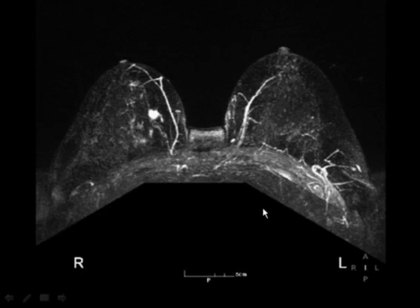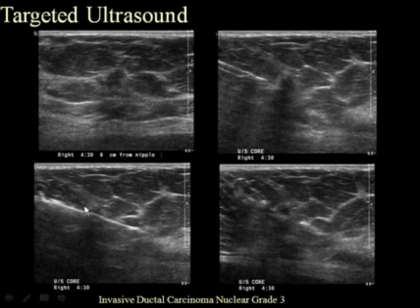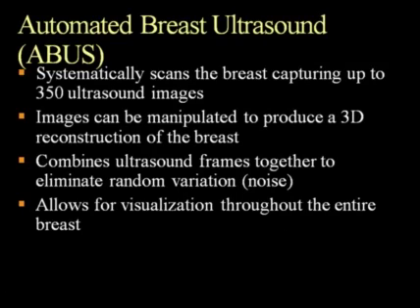The patient was also scheduled for MRI, so she went on after her mammogram to have her MRI, and we see this enhancing mass medially, very suspicious. So now we go ahead and bring the patient and do targeted ultrasound of that inner part of her right breast, and this lesion that's quite subtle, hypoechoic, angular margins, decreased through transmission is here, and this required a biopsy, and you can see our needle biopsy going right through it. This turned out to be invasive ductal carcinoma. So here's our needle up here and going through the lesion. This is a small lesion, so the ultrasound was very helpful as a second look ultrasound after the MRI showed us that region. Also, we could see it on the mammogram.